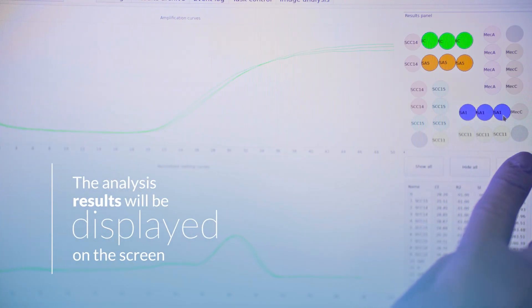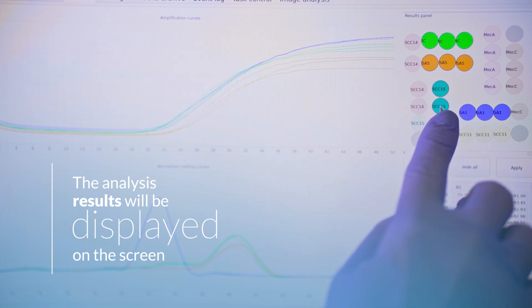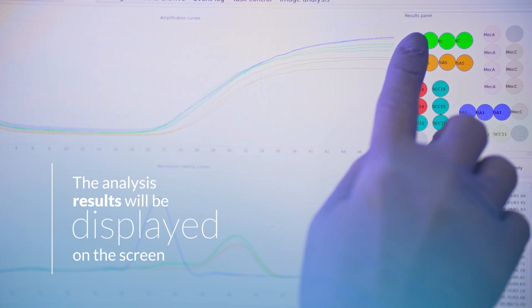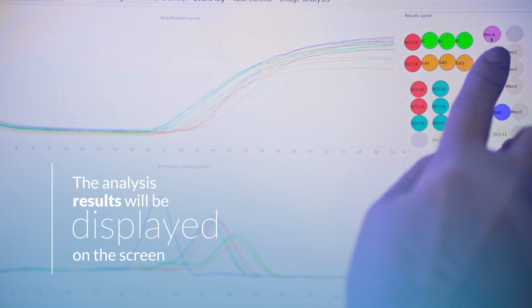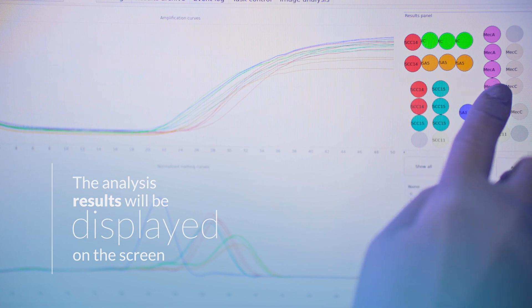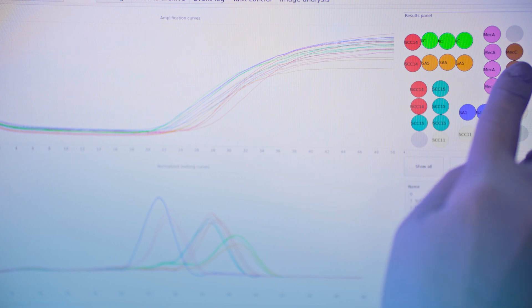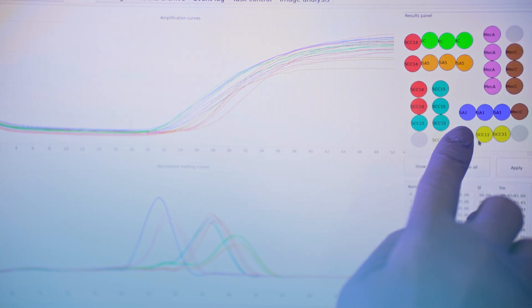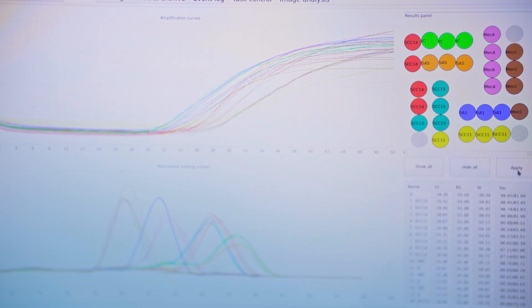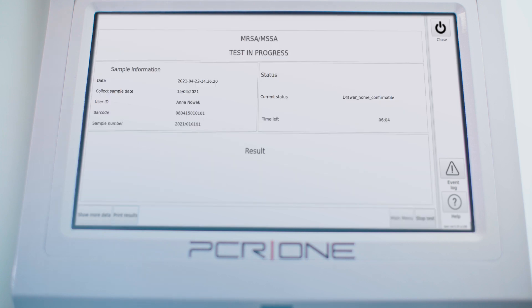In the test status window, the diagnostician can read the test result indicating the presence or absence of Staphylococcus aureus. The results will also distinguish whether the detected bacterium is resistant or sensitive to antibiotics. It is possible to view real-time PCR curves and read the results for individual primer pairs available in the panel. The reliability of the test is confirmed by internal control that reflects the entire process which takes place in the cartridge. The device not only performs the test, but also delivers the result.